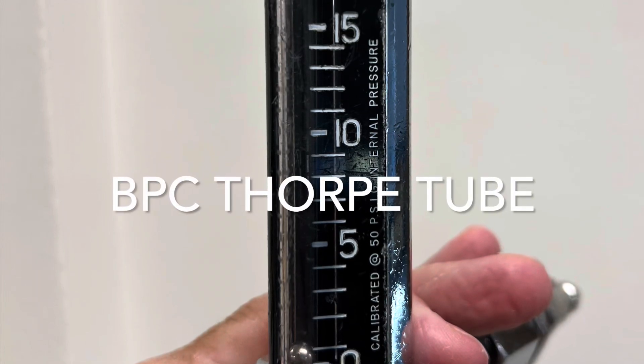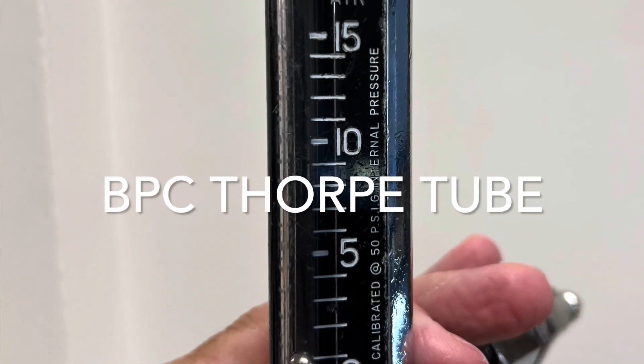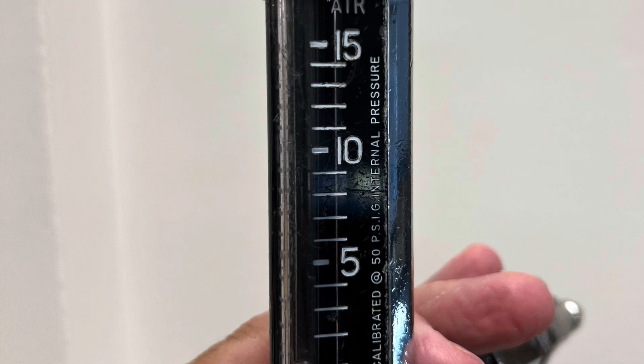Hi everyone. I'm posting a short video to show you how you can tell whether a Thorpe tube flow meter is back pressure compensated.